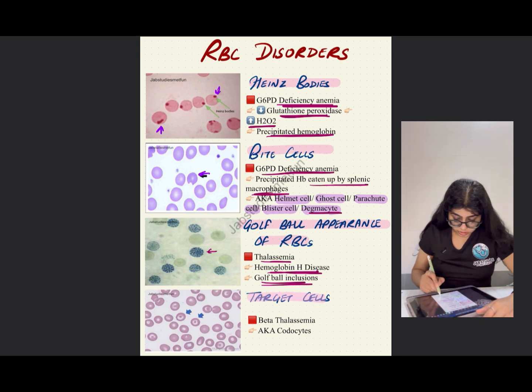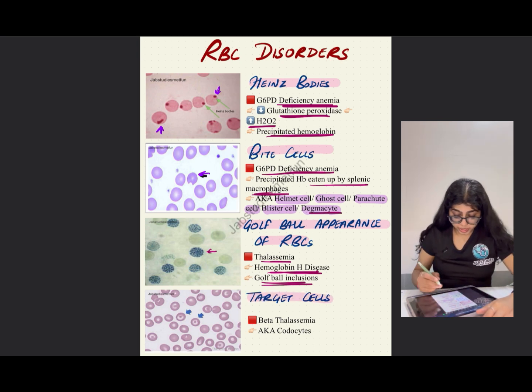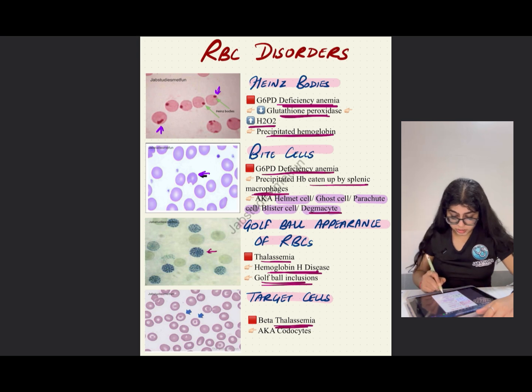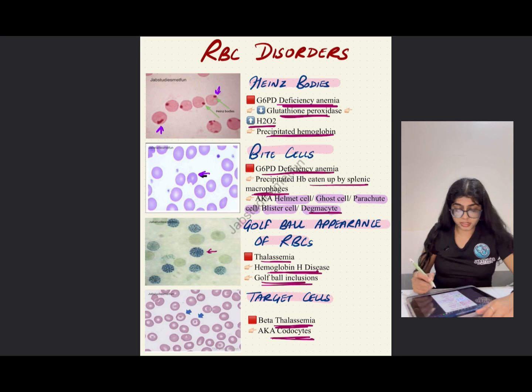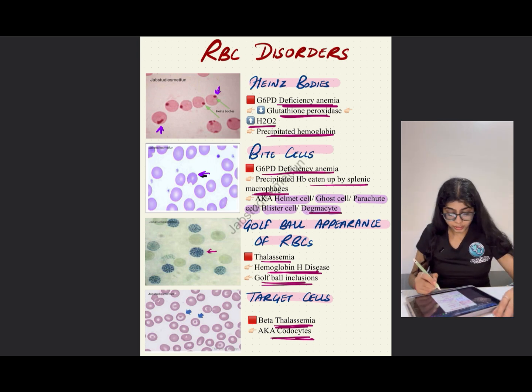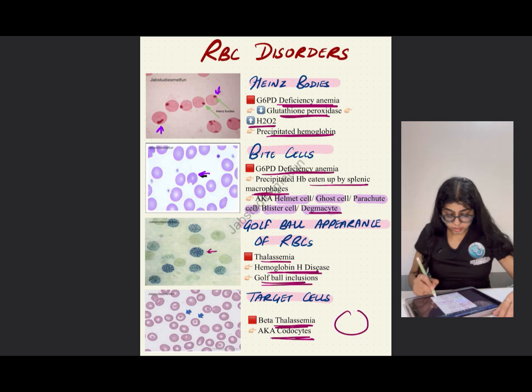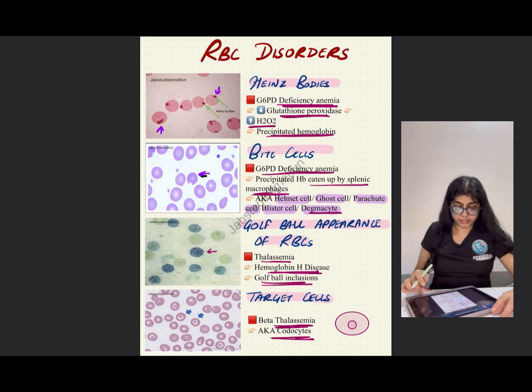Next is the target cell — another very commonly asked question. Seen in beta thalassemia, target cells are also known as codocytes. You can see that there is a target sign, like the targets used in archery, with an outer circle and an inner circle — it looks like a target sign.